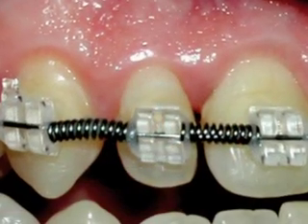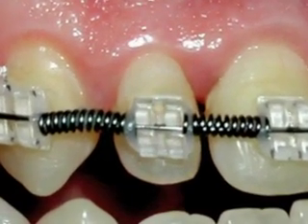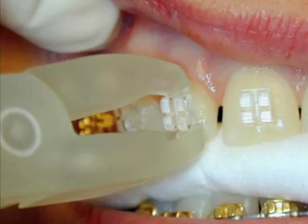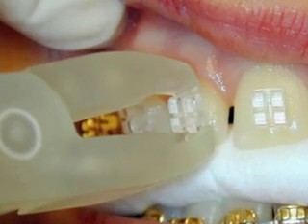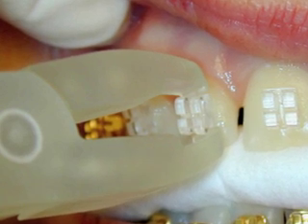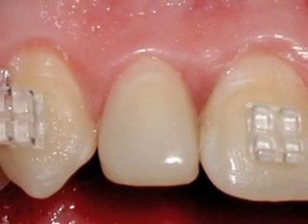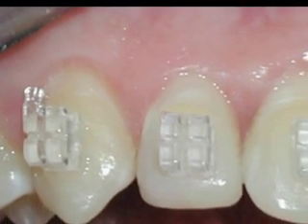Another example of a composite veneer was created by positioning the tooth, removing the clear bracket, creating the veneer and replacing the bracket to continue treatment. With a little practice, it's possible to create beautiful treatment veneers that serve to hold the ideal in-out position for final ceramic veneers or crowns years later.